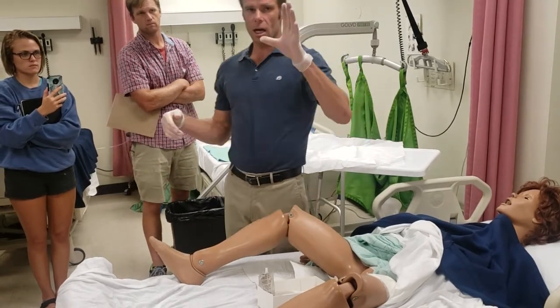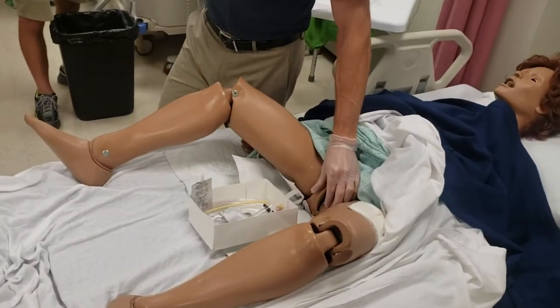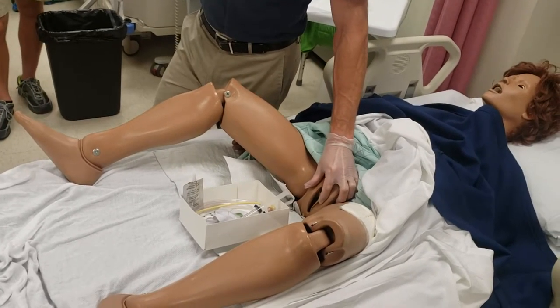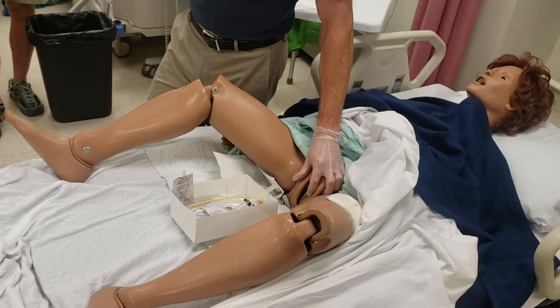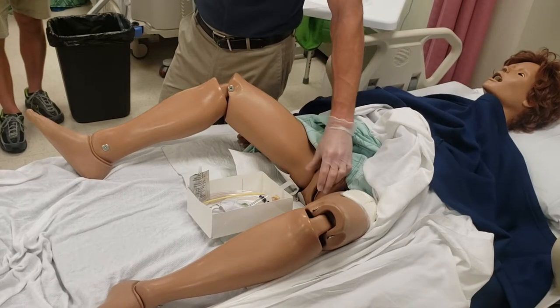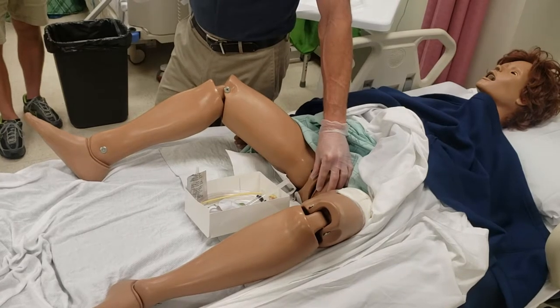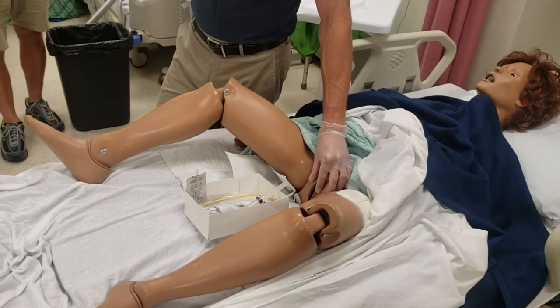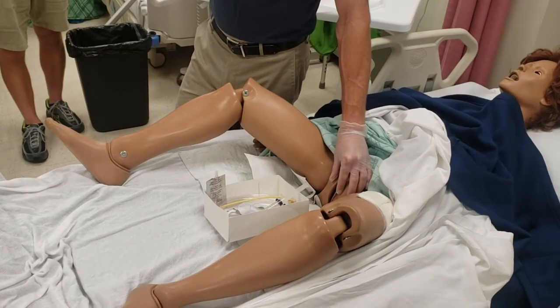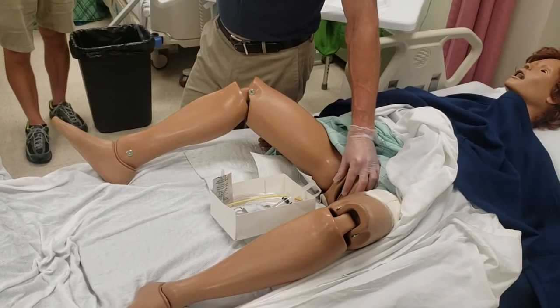If you're left-handed, go to the other side of the bed. I take my non-dominant hand and I separate the labia — not as easily done as said. You can keep manipulating the labia until you feel your hands will keep them apart. Once you start to clean, the labia cannot come back together — if it does, you must start the cleaning over. You can have a colleague put on two pairs of sterile gloves and separate the labia for you. Most of the time when we do female catheters there are three of us in the room — someone holds a flashlight, someone holds the labia, and we're all looking for the urinary meatus.